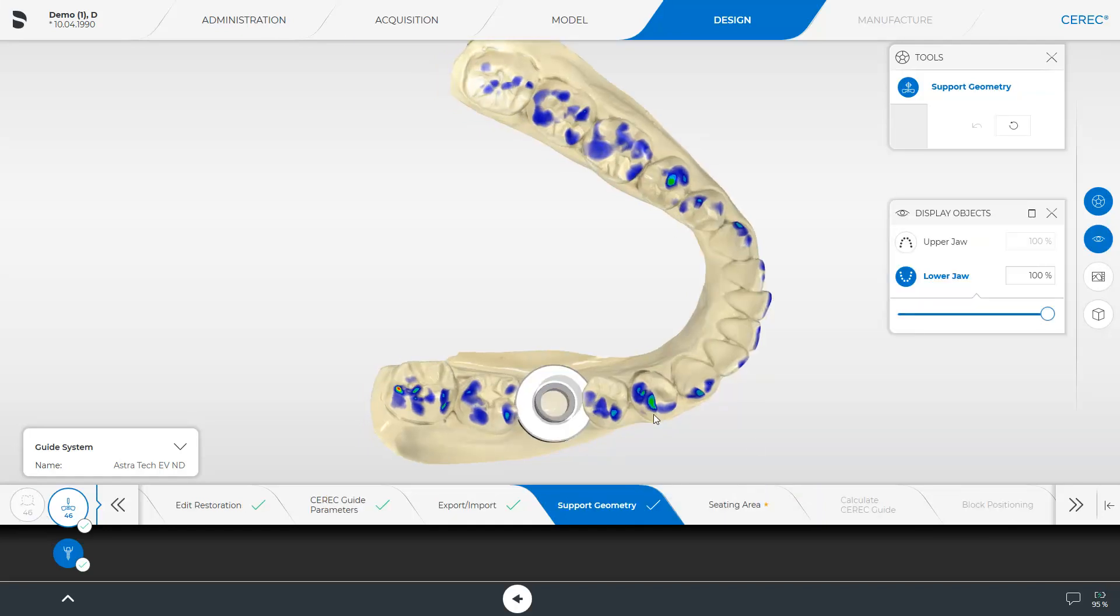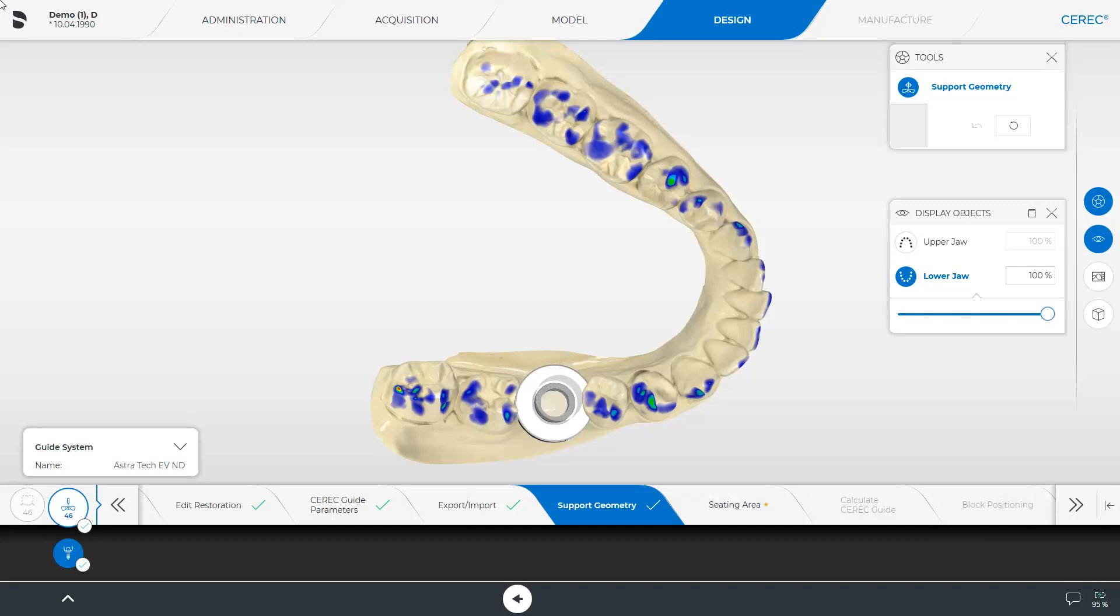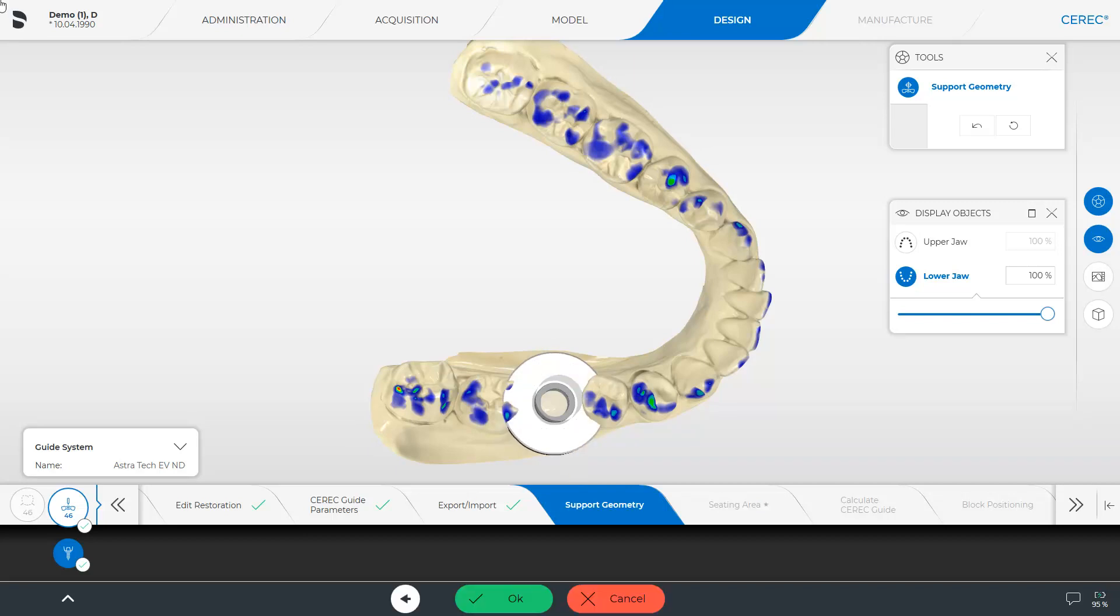The sleeve, which is fixed into the guide after the milling process, is stabilized by the so-called support geometry. If necessary, the diameter of this geometry can be reduced or enlarged by enabling the tool with the corresponding name. We move the cursor to the outer edge of the ring. As a result, two arrows are displayed, which allow for modifying the ring size by moving the mouse while holding down the left mouse button. For demonstration purposes, we'll zoom in and out on the geometry. You can then discard or confirm the change.